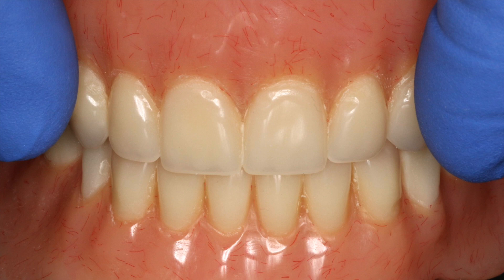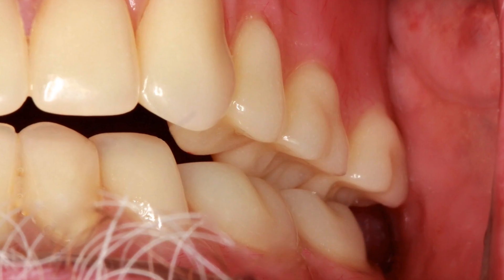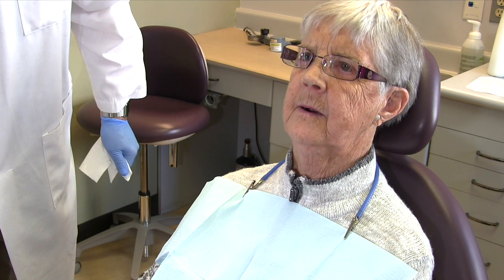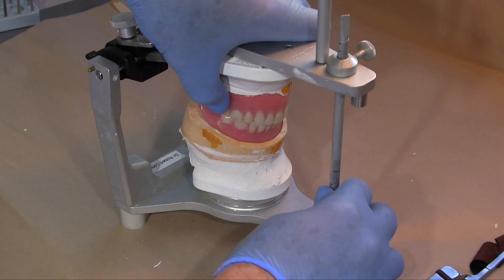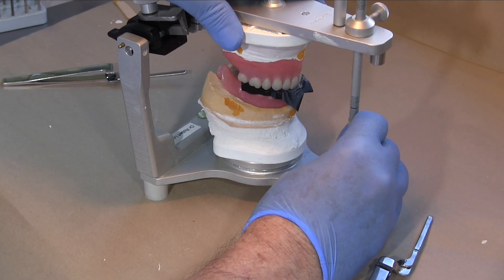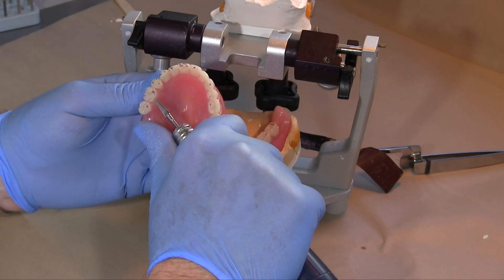You can sometimes feel this shift if you firmly stabilize the maxillary denture with the thumb and index finger on the canines and have the patient close in centric position. A second advantage of using a clinical remount is that the full extent of occlusal errors can be identified on remounted dentures. Patients tend to reflexively resist making movements that cause discomfort or dislodgement of their prosthesis, thereby masking the true extent of the occlusal problem.